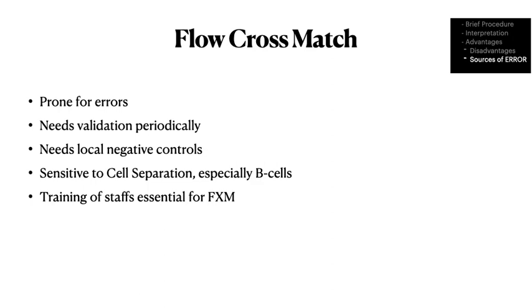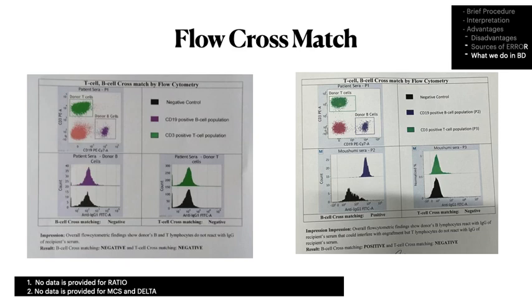It's an exceptionally important test, but unfortunately we need to be careful with the reports of this test. It needs a local negative control, and it's sensitive to cell separation, especially as B cells can get damaged during the separation. And training of staff is very essential for flow cross match, more than for the other two tests we saw.